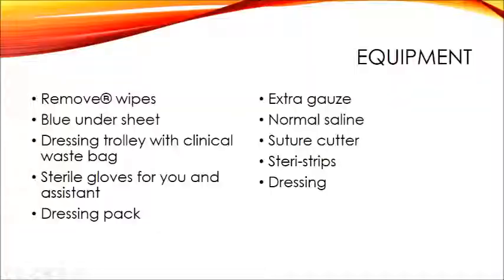On the thoracic ward, we use a 2-person technique to remove chest drains. As the person removing the drain, you will be responsible for communicating with your patient as well as your assistant. The assistant's role is important in supporting your role and is responsible for the post-removal dressing of the drain insertion site.